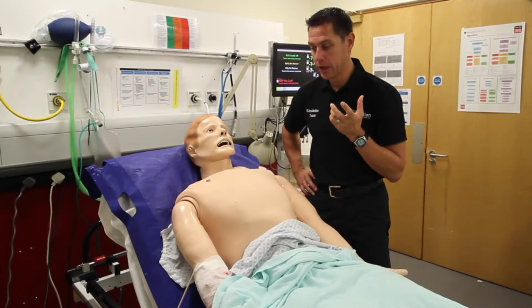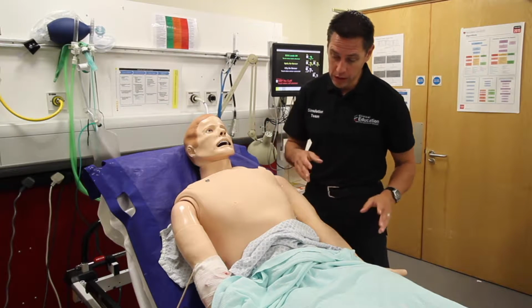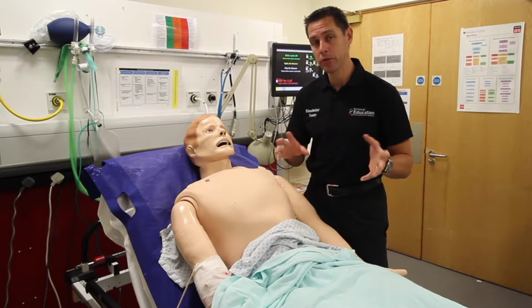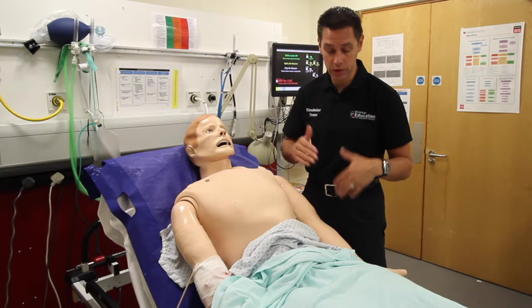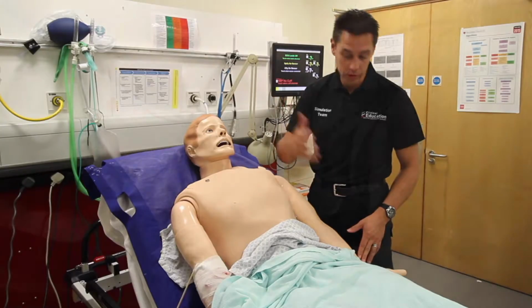So in terms of circulation assessment in your mannequin, in terms of how you might do that, we can start with pulses. So he's got radial pulses, and he's got all his peripheral pulses, and he's got central pulses. The pulses will be generated and they're based on blood pressure. So if his blood pressure's in his boots, don't expect to find a radial pulse. So very much when you're looking, you're monitoring and you're feeling your pulse, and put the two and two together.